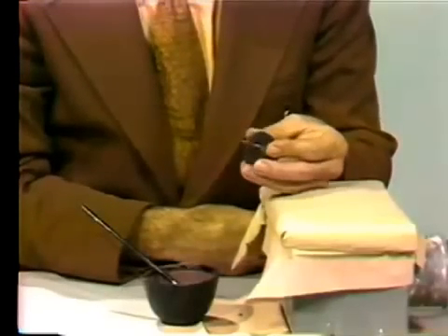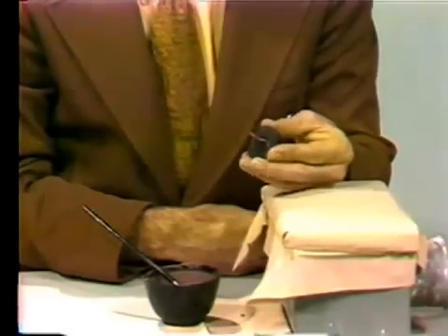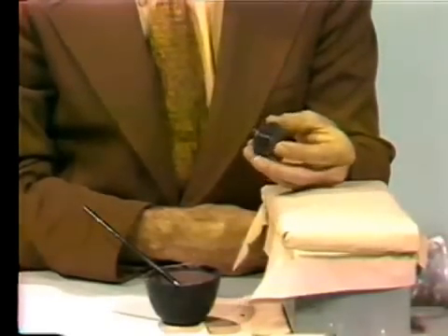Now I believe the entire surface of this wax pattern is covered with the investment, as you can see.